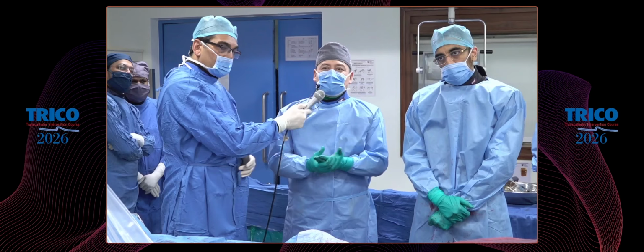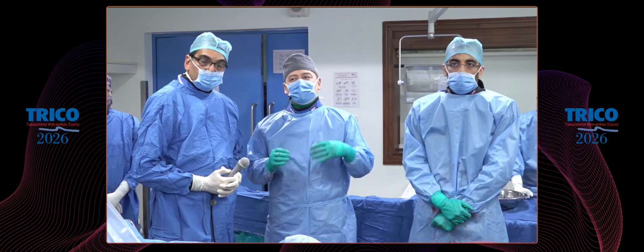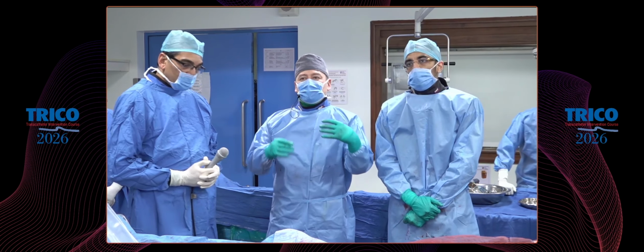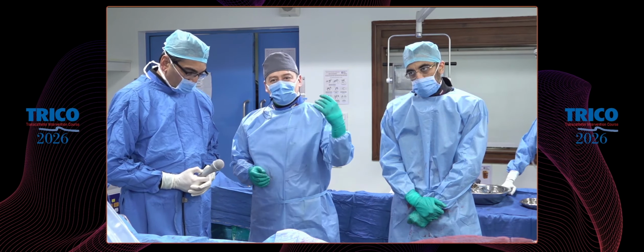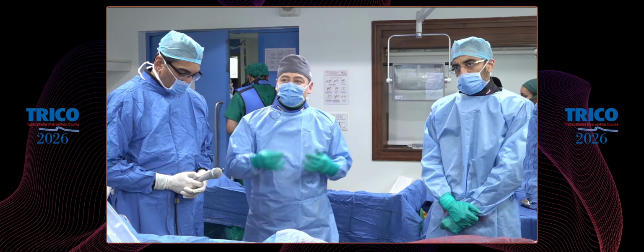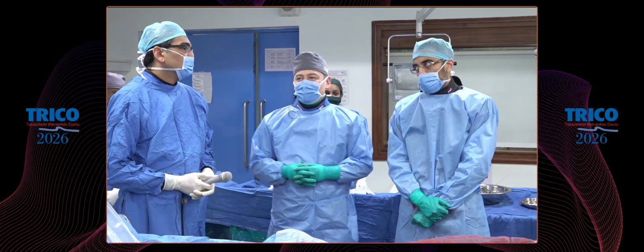And we should know that usually in patients with the bicuspid aortic valve, this procedure should be the last procedure for the patient. I mean, it will not be necessary to use a second valve or third valve, but if we know that this patient will need a second valve in 7-10 years, the choice, if the anatomy allows us, is to use balloon expandable, we'll use balloon expandable.